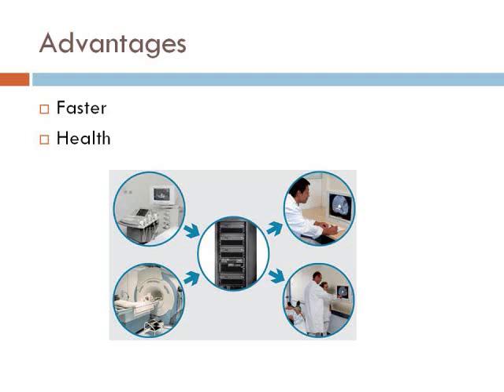The radiologist has access to it, so they can make their notes and their transcription to it. It also allows the nurse to be able to look at it right away, or even another specialty clinician or physician to have access to that image as well. So it allows them quicker access, and it also allows the patient to be diagnosed a lot faster, or for the physician to figure out what exactly is wrong with their patient, especially if they're waiting in the ER to be released, or if they're waiting in one of the floors in the unit.